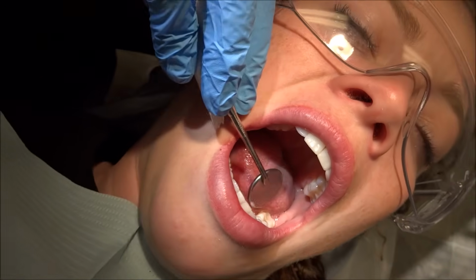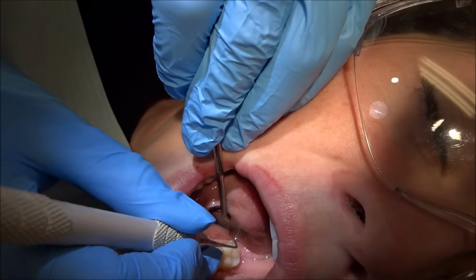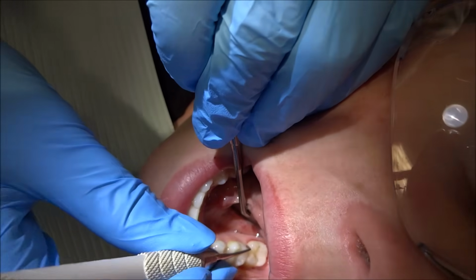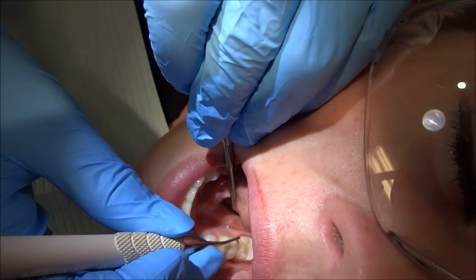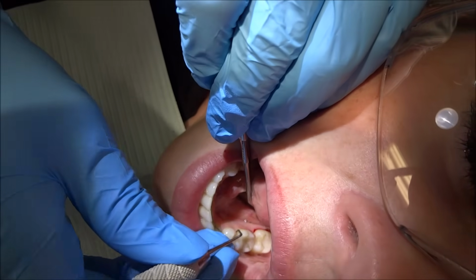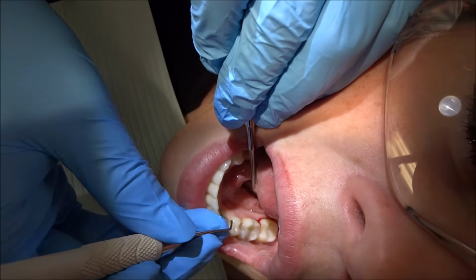Then coming down to the lower. I come in from the mesial and then I just pop right over that tissue to do the distal of the next tooth. Makes it more efficient versus coming in, doing the mesial, then coming out and inserting back in. Just helps the flow a little bit more.